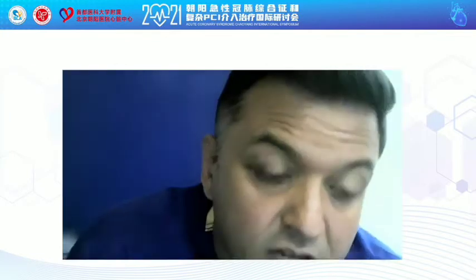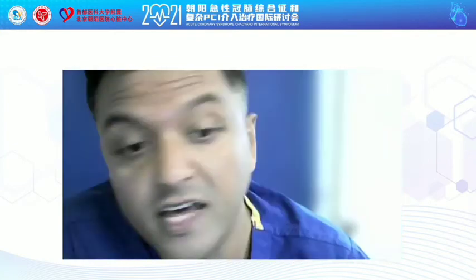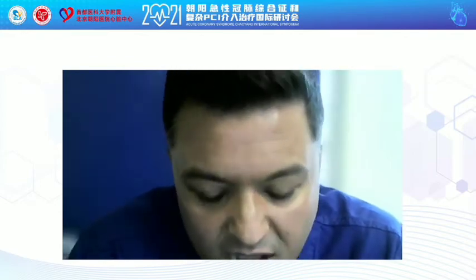I think that's exactly right, understanding that balance of risk about how easy it is to deliver things. In that case, if you look at the angiogram again, there was a lesion beyond the critical lesion that was our problem. There was mid vessel disease, which was not severe. And you feel that once you're through the actual tightest part, you should be able to deliver and wire the vessel quite easily.